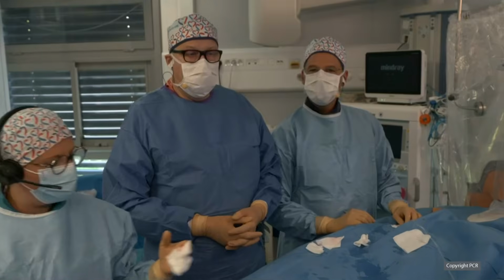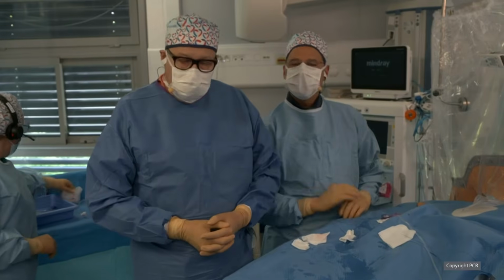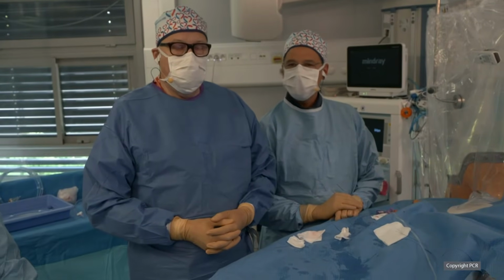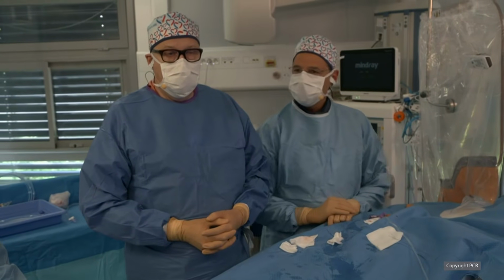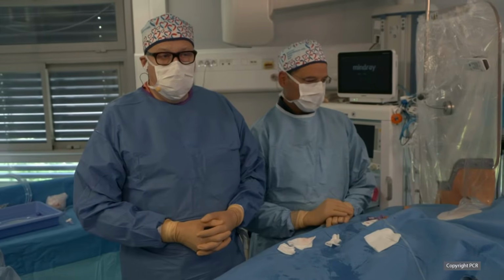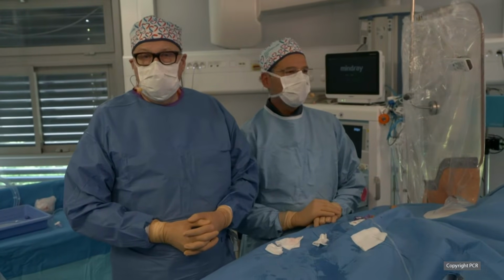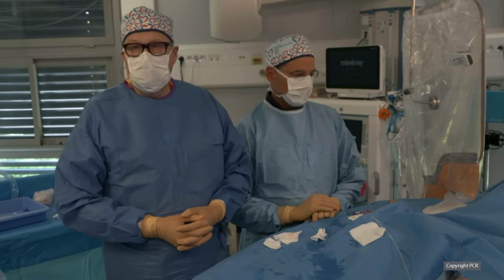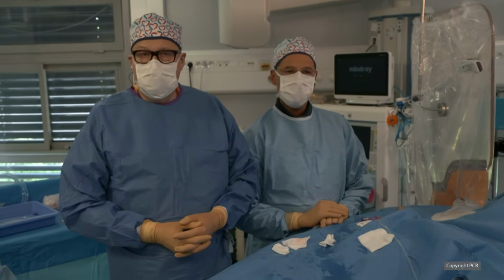Okay, good afternoon. Good afternoon, everyone. Welcome in Massy. We're very delighted to be in this session with you. I'm going to do the case with my colleague Bernard Chevalier and Dr. Onuma as OFDI expert. We are doing the case with an anesthesiologist, Dr. Dermosh, and Sophie and Natalie as nurses.